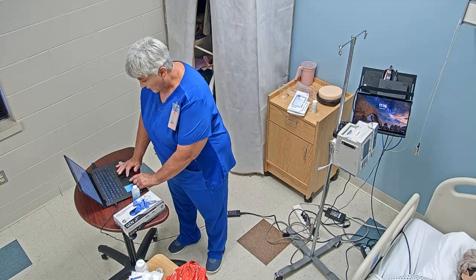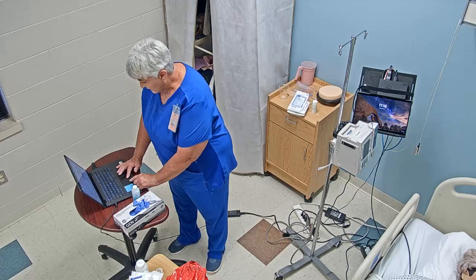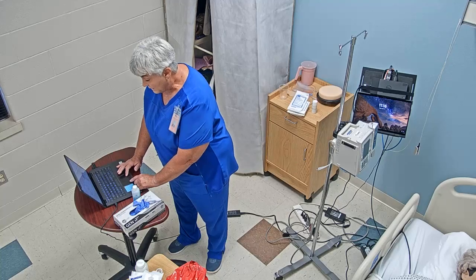I've got Anna Taylor, and her date of birth is 4/24/1991, and she's not allergic to any kind of medications. Colon mass with a colon resection, and so I'm going to go down, and it says I'm going to do a sterile dry dressing change to the abdomen daily using 0.9% sodium chloride.